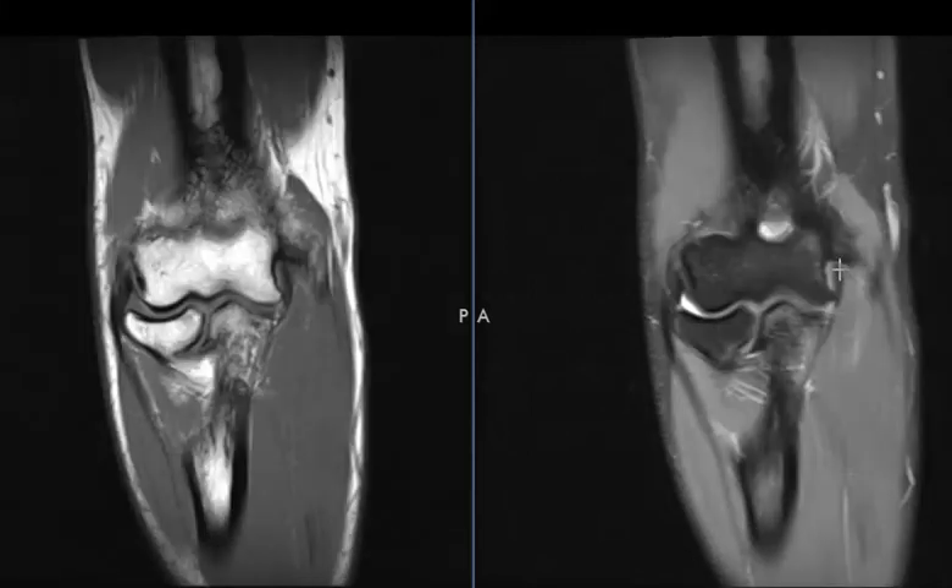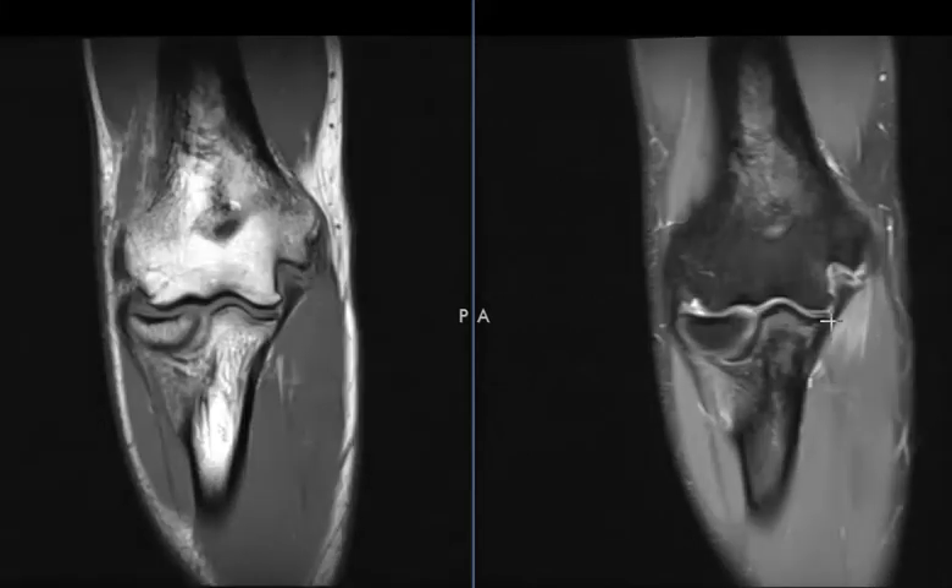The anterior band looks like it's intact. It also has a posterior band right here that's thicker, and a broad band that attaches to this horizontal shelf. This patient has a torn posterior band of the ulnar collateral ligament.